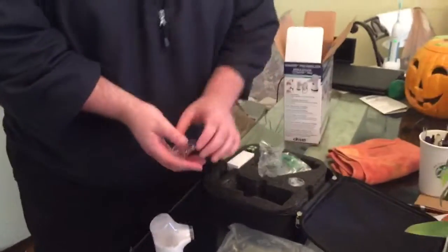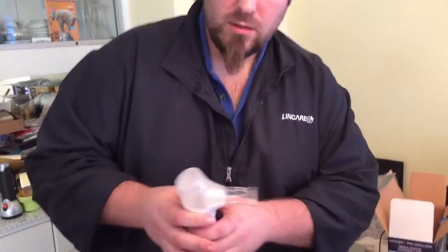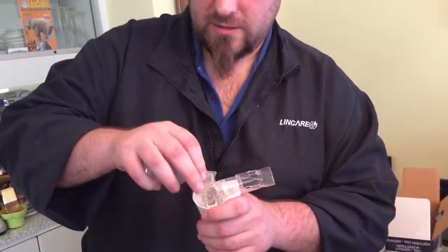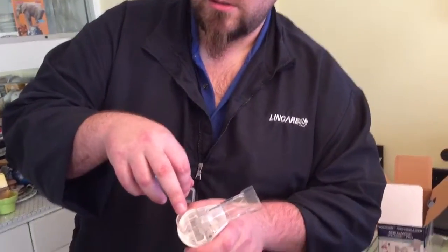You have your mouthpiece here which goes directly onto this end, just like so. You'll have to open this cap up and open this little lid, and this is where your medicine goes.